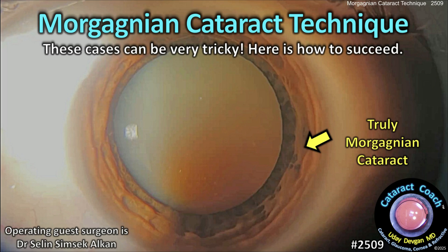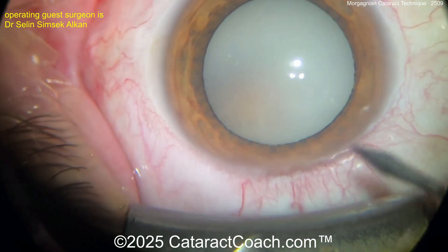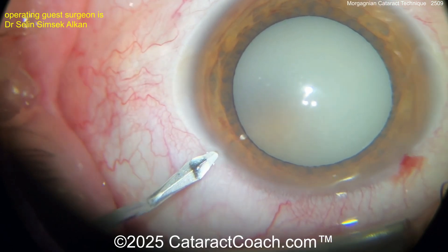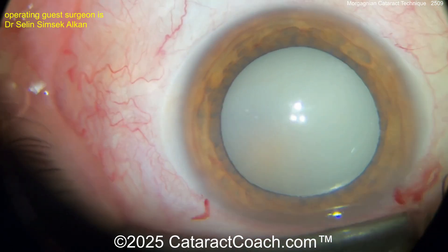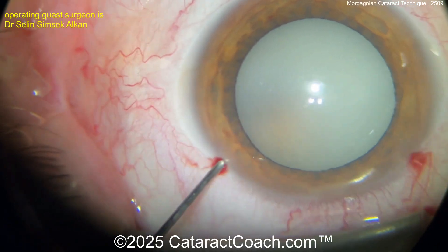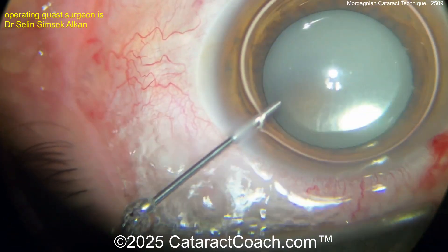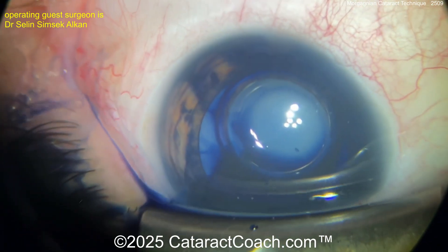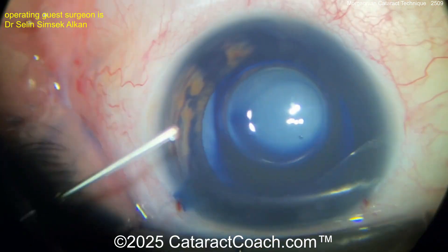cataractcoach.com — Morgagnian cataract technique. Now these cases can be very tricky. Here's how to proceed. Look at that pre-op picture. Wowza. You can see this is a very white cataract. It's intumescent. A lot of the lens material has liquefied. What you're left with is a dense little central endonucleus that's floating within this bag of fluid. That's the Morgagnian cataract.